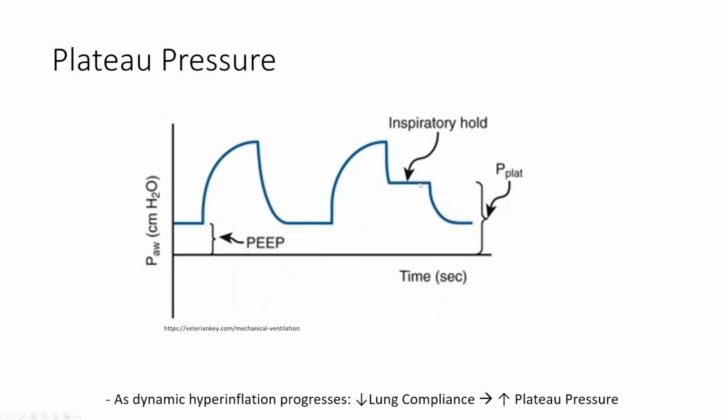So looking at the plateau pressure just in and of itself doesn't tell you that there's auto-PEEP. But once you've had a patient on the ventilator and you've had some baseline parameters of what they initially look like, if you're doing progressive checks and your plateau pressure seems to be progressively rising in combination with a patient who's no longer doing quite as well, hemodynamically maybe unstable, or developing hypoxemia and hypercapnia, it's something that you can definitely suspect.